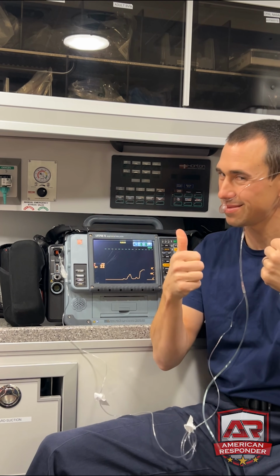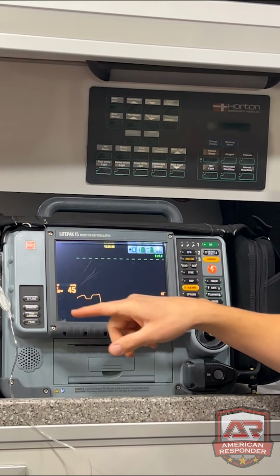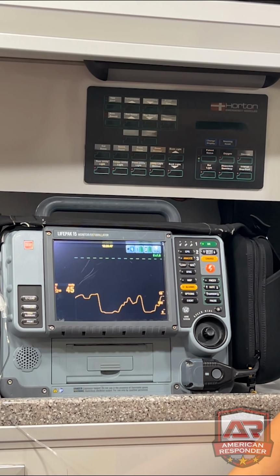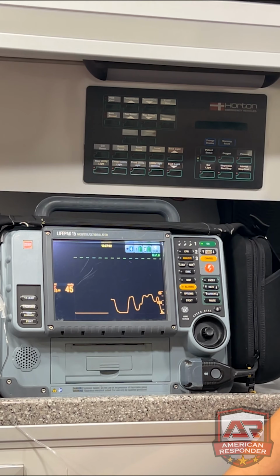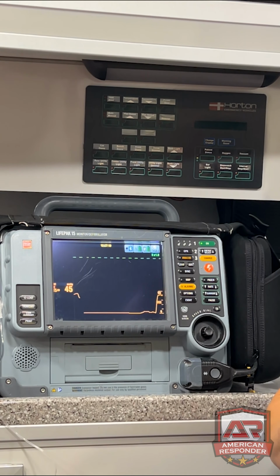Isn't it a cool, stylish thing? I know, right? All right, so we're going to see what my respirations are right now. As you see on the monitor, my respirations are 22, and my end tidal is 45. Normal is 35 to 45. Now we're going to do a test, okay? I'm going to hold my breath and let's see what it does. As you see, it flat lines, right? It does nothing. Why? Because it's measuring the carbon dioxide.